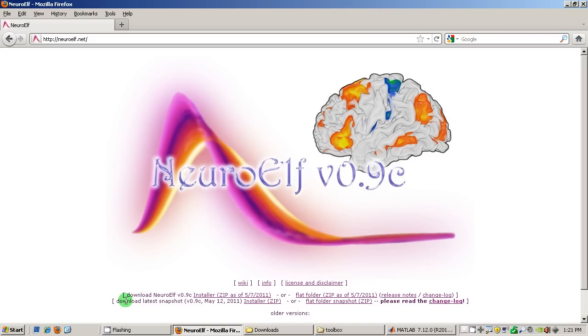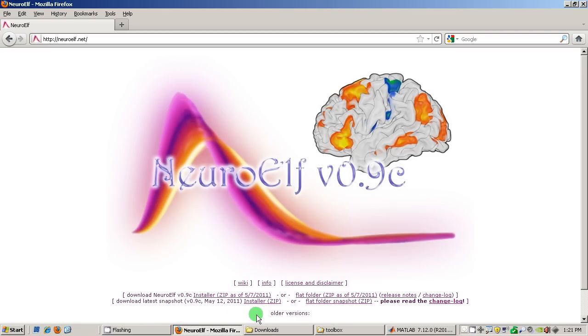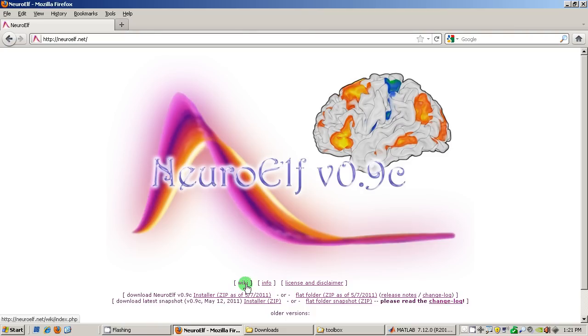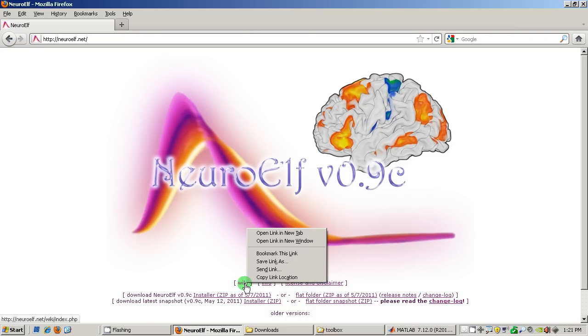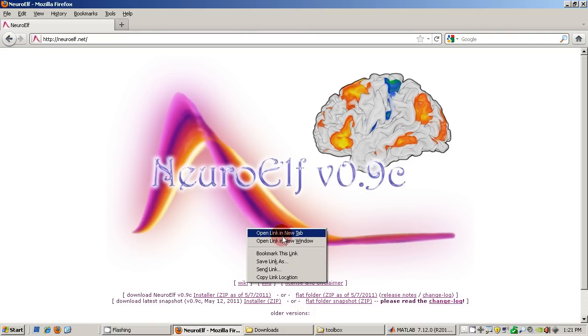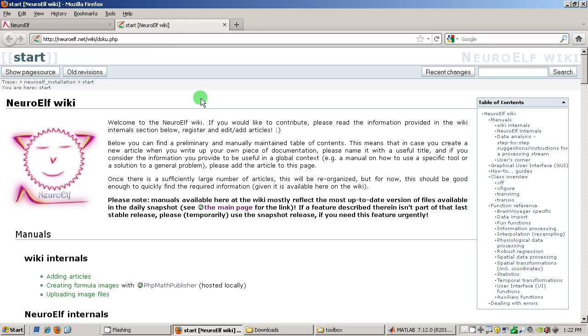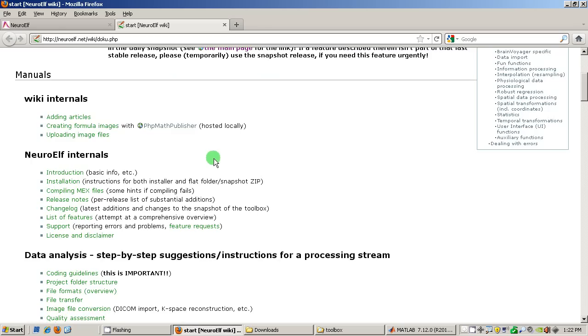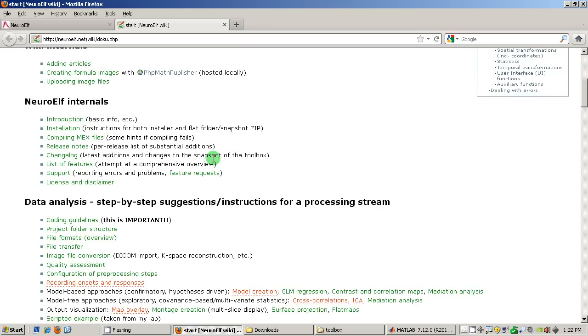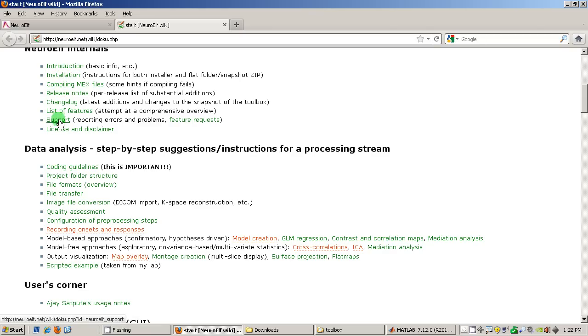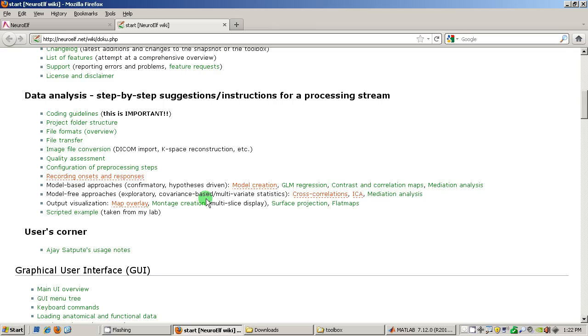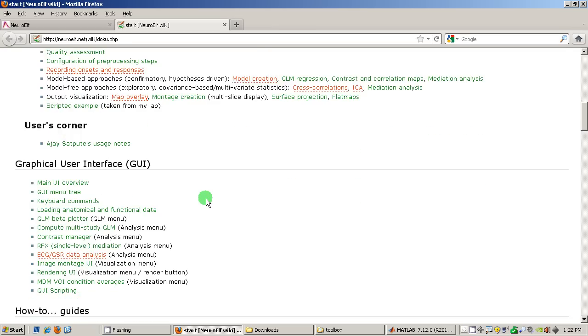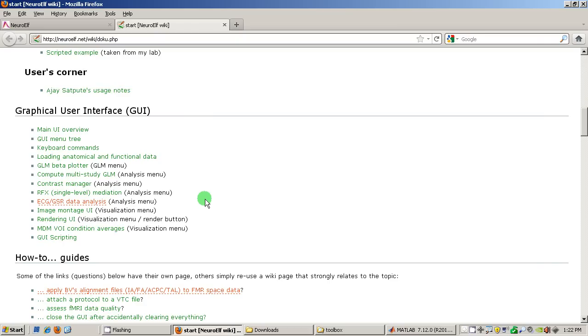So I already downloaded this but before I go there I want to quickly point out that there is also a link to a wiki page which I will open in a new tab and quickly show what this is about. You'll find documentation about NeuroElf here, how to install it, if you have problems, what features are implemented, how to set up your study, your folder structure and then how to use NeuroElf.